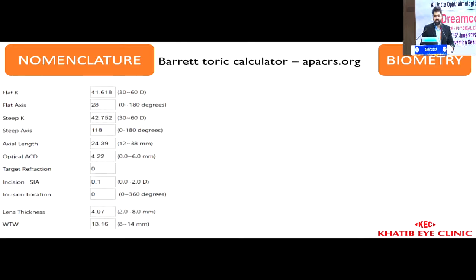Coming to your other two theoretical parts, that is your biometry and nomenclature. Now when you say toric IOL biometry, you have individual IOL company calculators which have their own, but the safest and the best calculator which you can use is the Barrett calculator, which is freely available online. For the latest version, you should go to apacrs.org and go to the Barrett toric calculator and just feed in the details there. That will give you the best results.